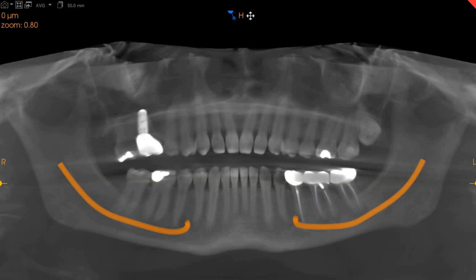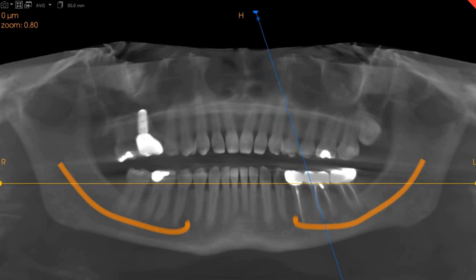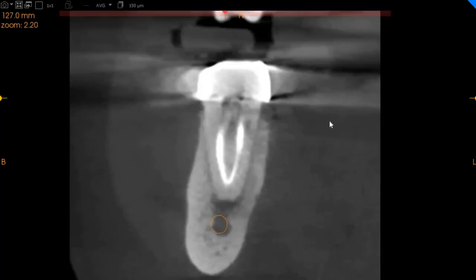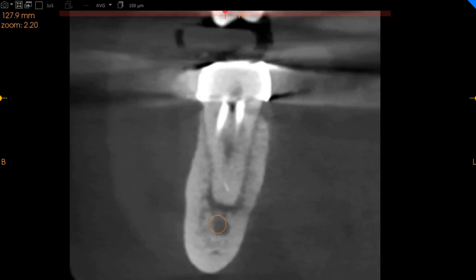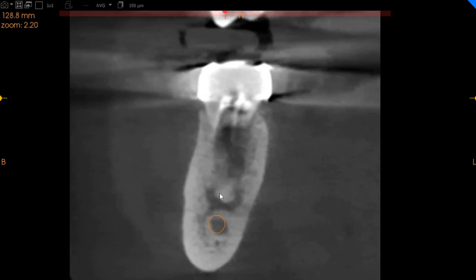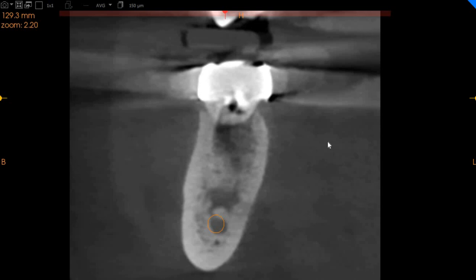Focusing on the lower left 6 and 7 first, this is the transaxial view which is basically the proximal view. Here you can clearly see that both the mesio-buccal and the mesio-lingual canals have been obturated. However, they are just approximately 1.8 mm short, and we do see a periapical radiolucency associated with these teeth.